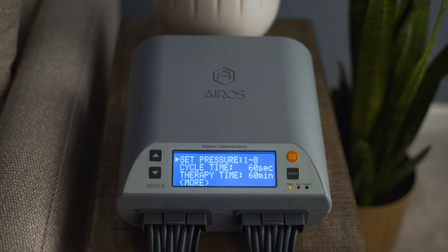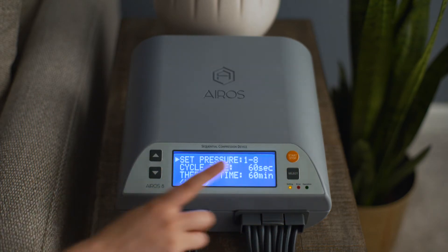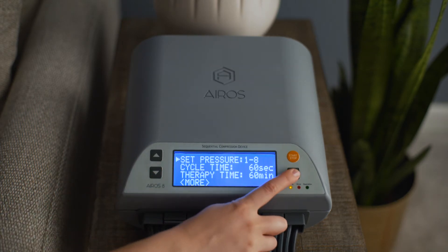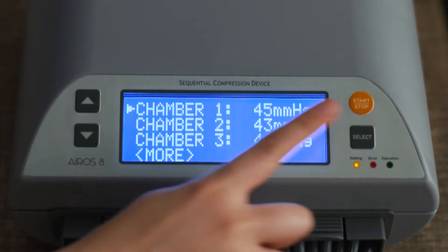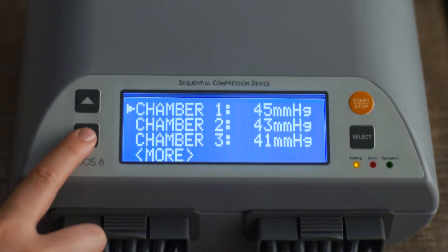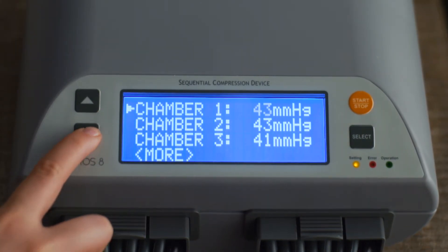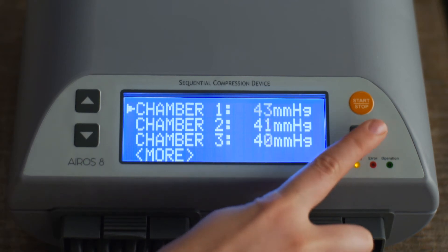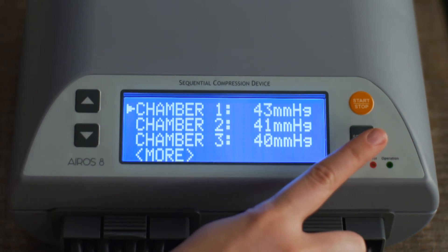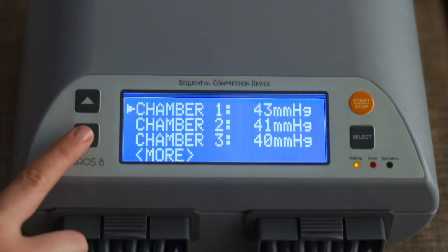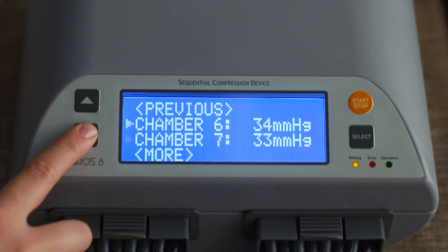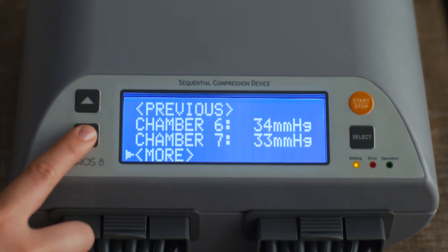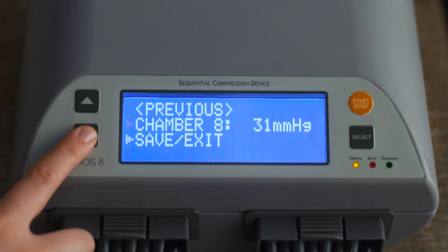To set the pressure in each chamber, scroll to Set Pressure and press the Select button. In Chamber 1, pressure can be set from 35 to 80 mmHg. Press the Select button to confirm your selection. Once the pressure is changed, the pressure in the following chambers will automatically be reset at a 4% decrease.